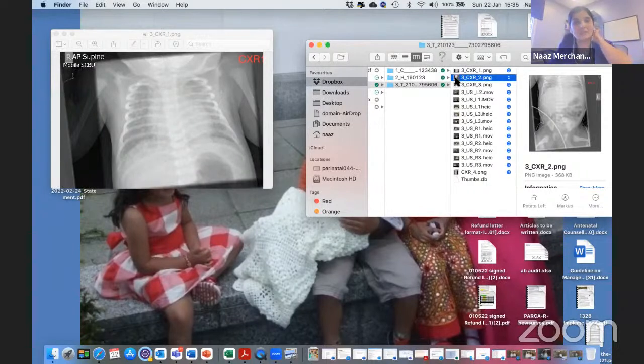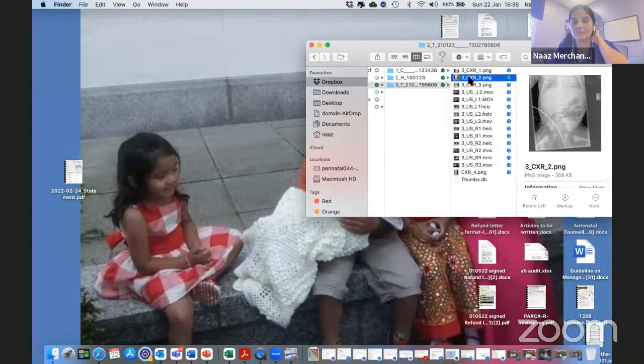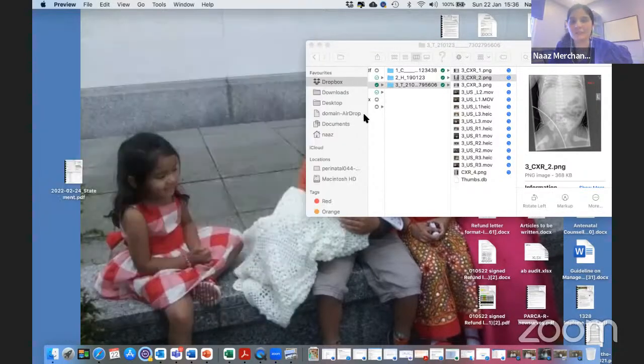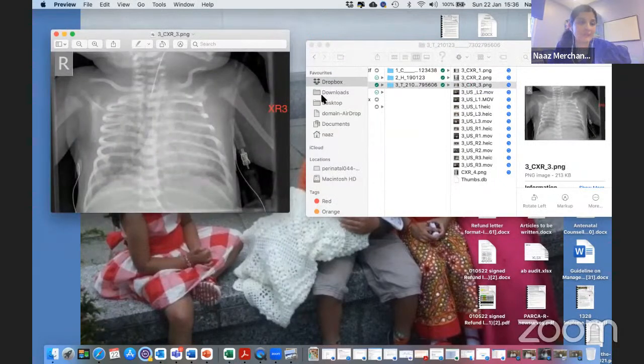So we intubated and ventilated the baby, and required a tidal volume of 6 mL/kg with pressures of around 30 to 35 to achieve that tidal volume in 100% oxygen. Then the baby had to go on nitric and get transferred out. This X-ray doesn't show much of the lungs, but as you can see, there are a lot of patchy white infiltrates. It was mainly done for the UVC, which we were putting in at that point. I have another X-ray where the baby's been intubated, around 4 hours of age. You can see the heart border is pretty much not visible, and there are multiple patchy infiltrates in this baby.